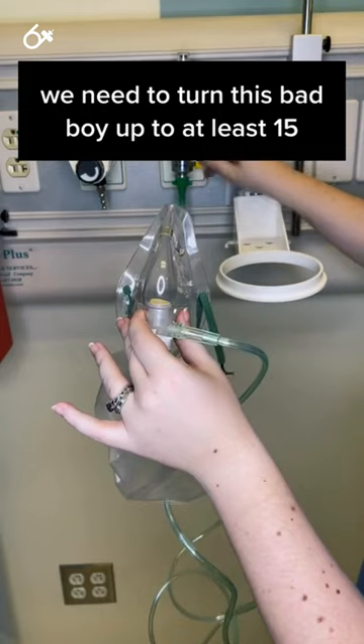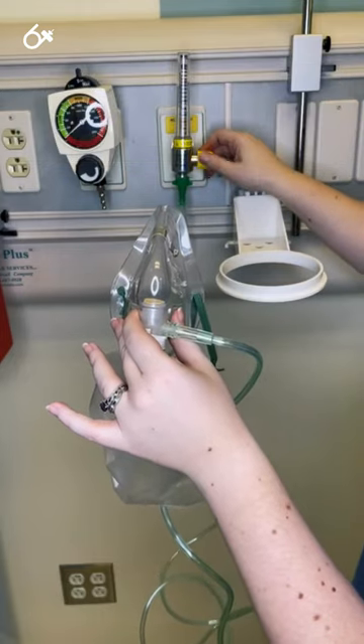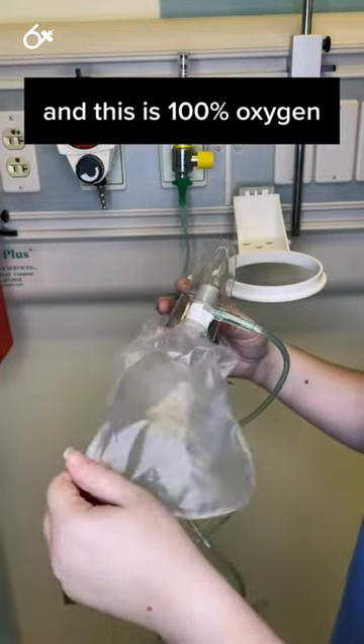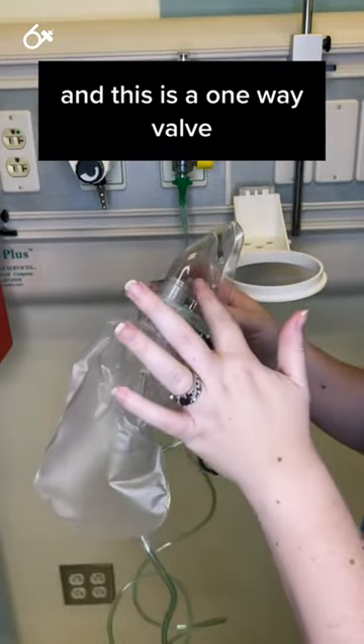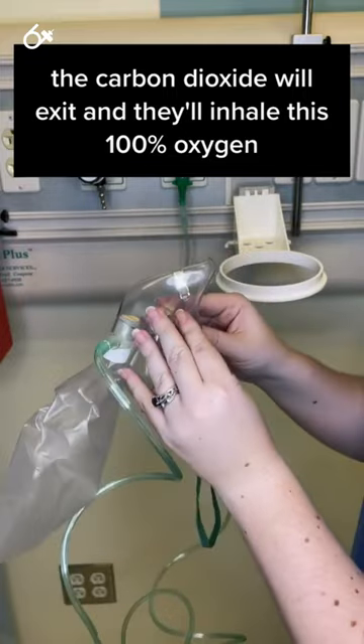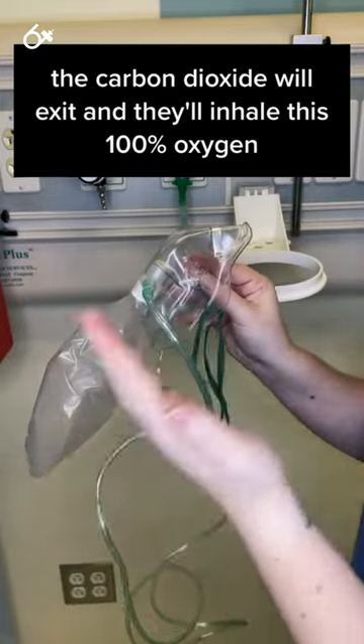we need to turn this up to at least 15. Now you can see that the bag is beginning to inflate, and this is 100% oxygen. This is a one-way valve, so they'll exhale, the carbon dioxide will exit, and they'll inhale this 100% oxygen.